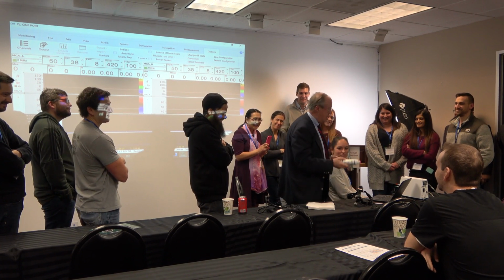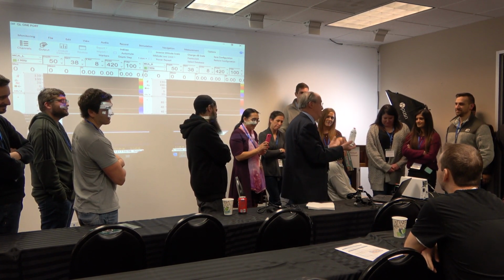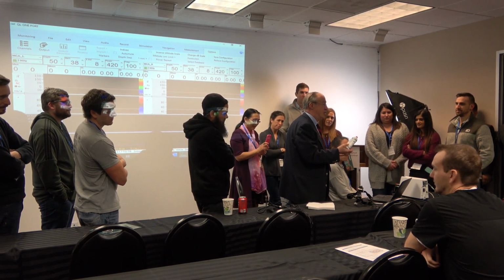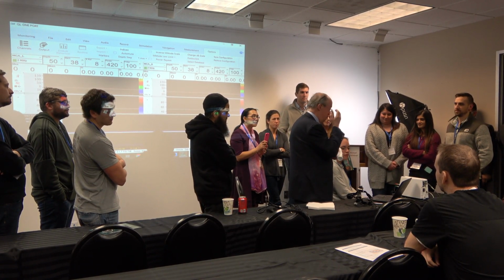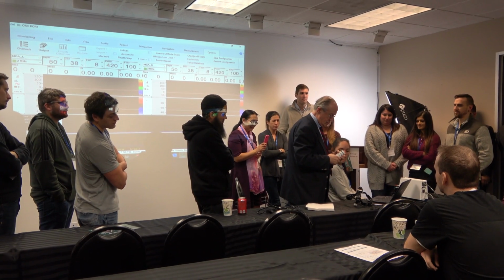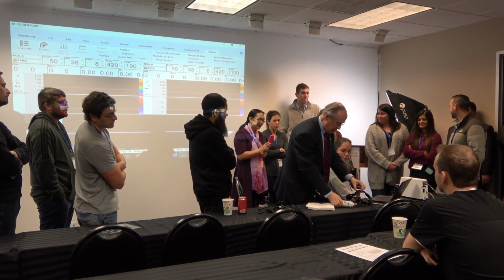What we are doing, in my opinion the most unpleasant part of the whole test, is the gel that we need to put on the patient's head. All right? So let's do it.